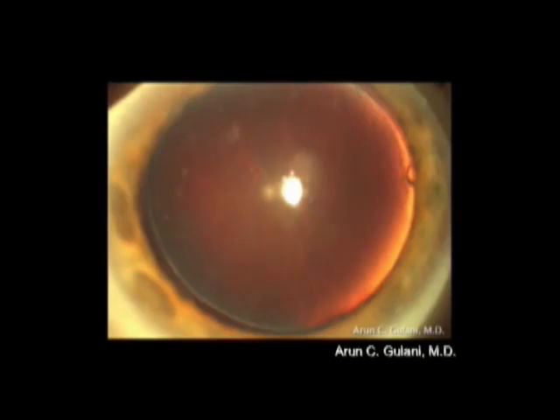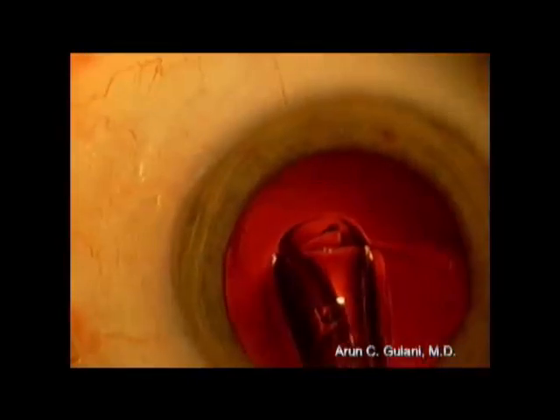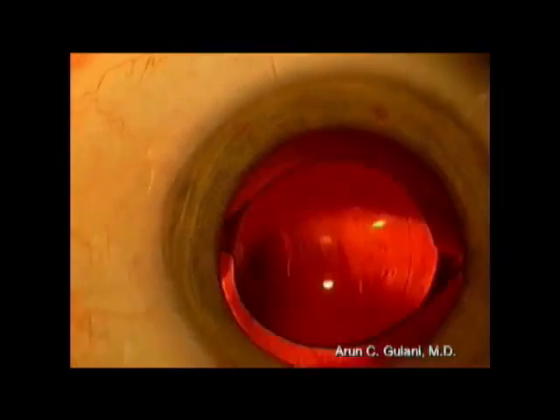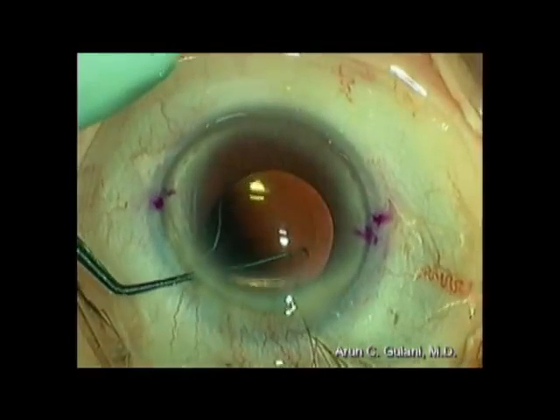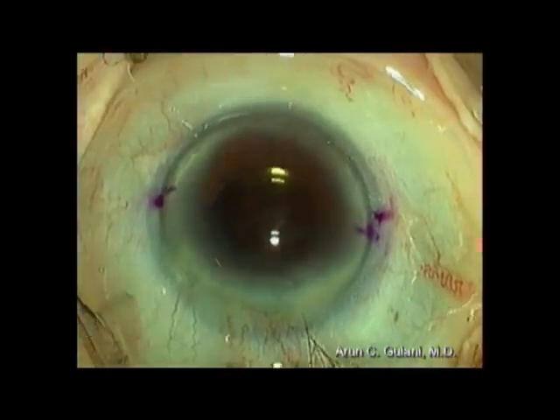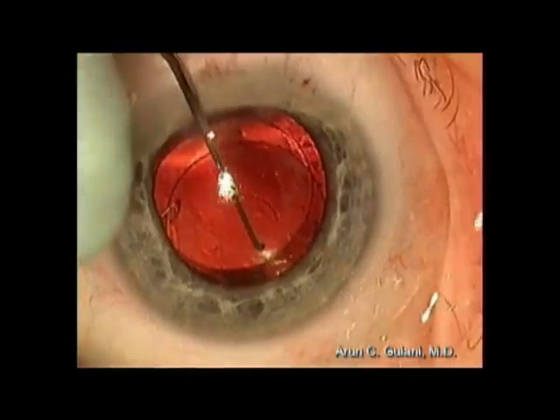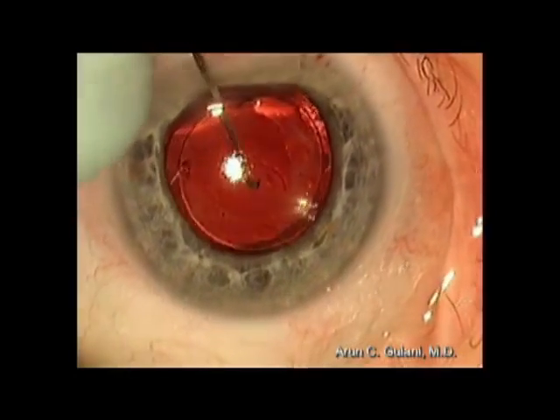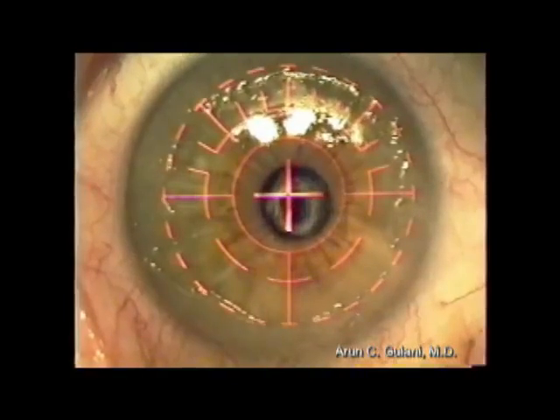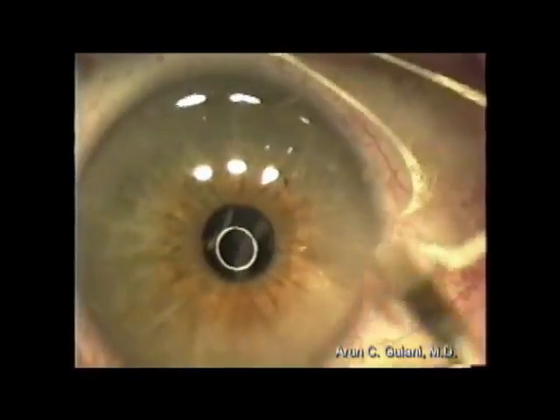Phakic implants like the Visian ICL, monofocal intraocular lens, toric intraocular lens, and even piggyback intraocular lenses can be used to manipulate the optics of keratoconus intraocularly, followed by surface excimer laser to correct the ametropia for a great refractive outcome.